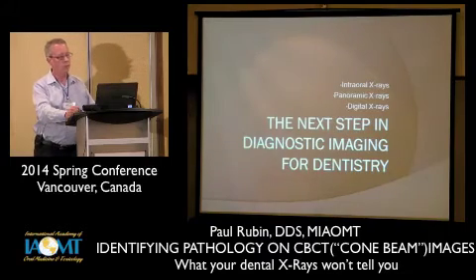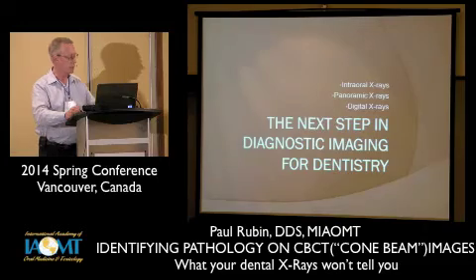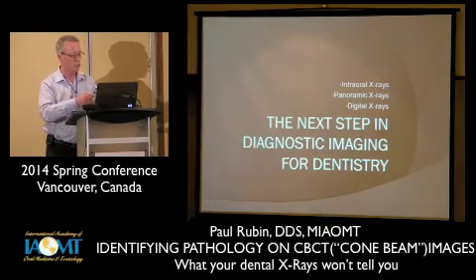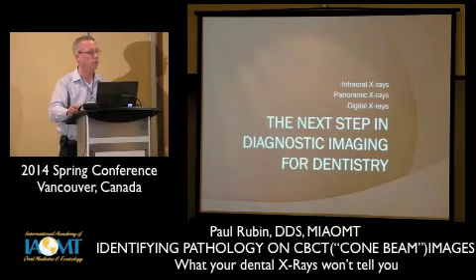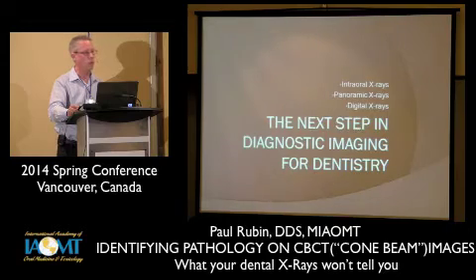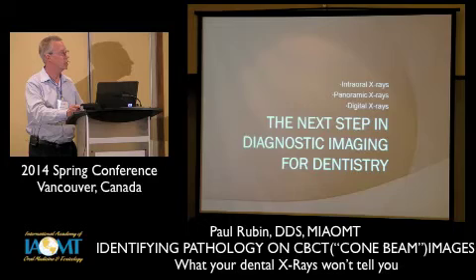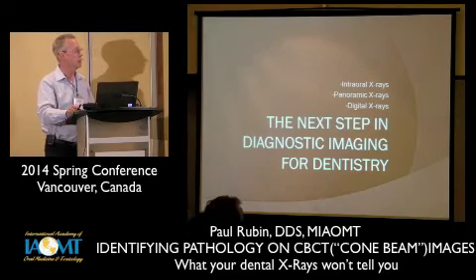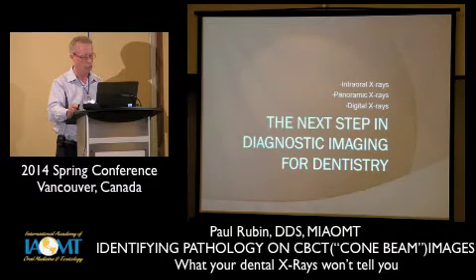So we've gone through an evolution in imaging for dentistry. We've had, of course, intraoral X-rays for a long time. The next step up from that was panoramic X-rays. Digital came along, giving us a lot more abilities of manipulating images, lowering dose, and so forth. And the next step in diagnostic imaging for dentistry is the cone beam X-ray.